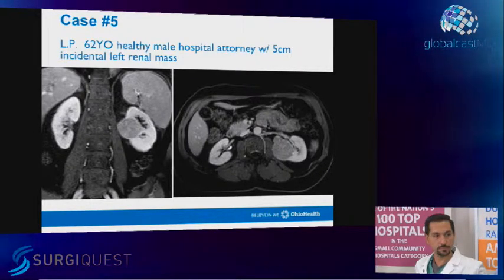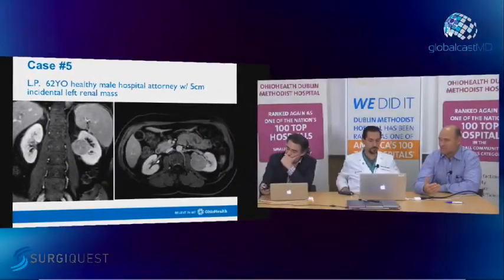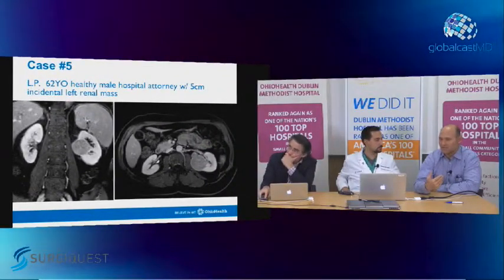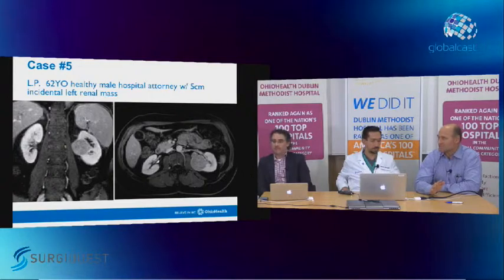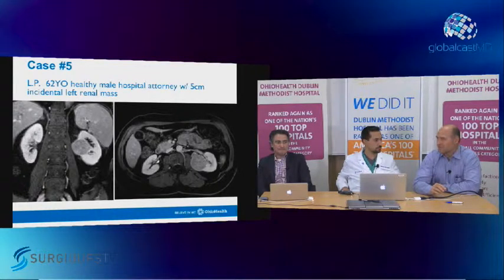Right. Well, what I like to do in these hilar tumors is, first of all, I get complete vascular control. That means arteries and veins exposed, because when you're in the hilum, you're going to have larger vessels to deal with. We're not talking about sinuses. We're talking about branches now. So these are the cases where I will clamp the vein in most cases, because you get a lot of venous backbleeding in those cases.